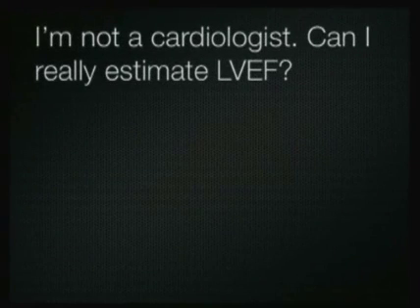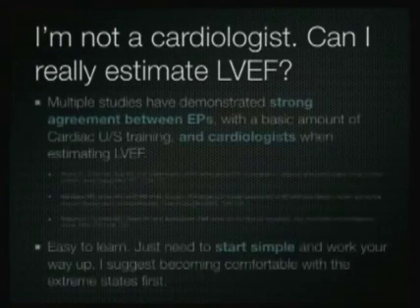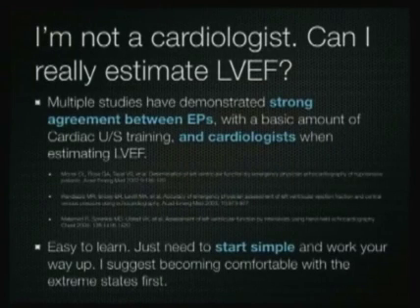So you may ask yourself, I'm not a cardiologist, can I really estimate a left ventricular ejection fraction? Multiple studies have demonstrated strong agreement between EPs, emergency physicians with a basic amount of cardiac ultrasound training, and cardiologists when estimating LVEF. And so it's easy to learn. You just need to start simple and work your way up. And I suggest becoming comfortable with the extreme states first. Let me show you a couple examples.